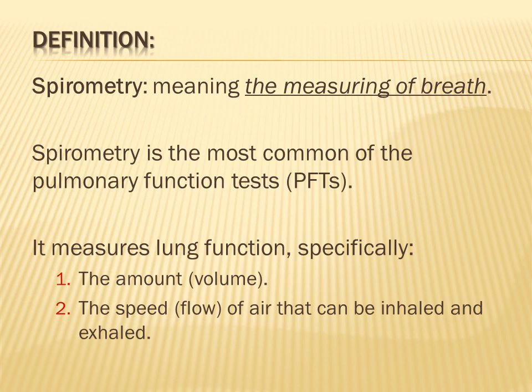The pulmonary function test is not a single test. In fact, it's a group of tests. One of the most important tests within the pulmonary function test is spirometry, meaning the measuring of breath. Spirometry is the most common of the pulmonary function tests, as I told you.